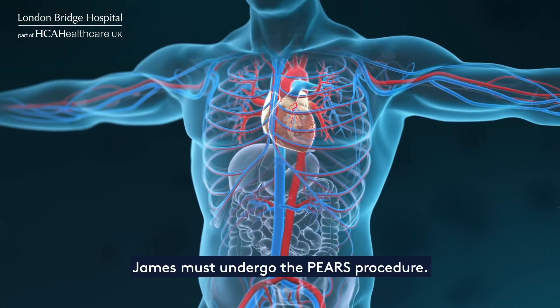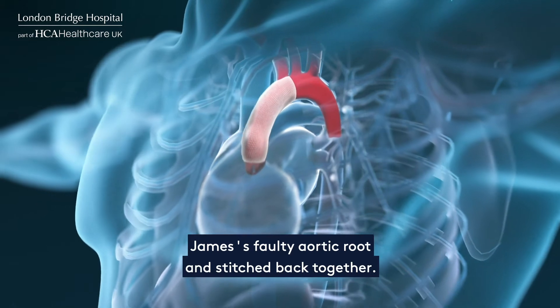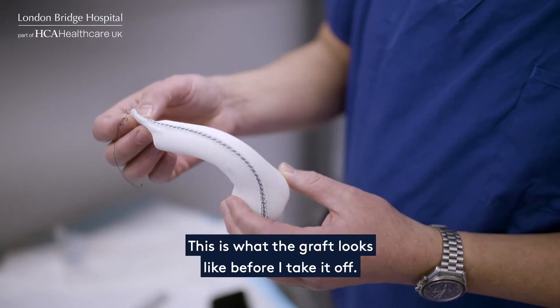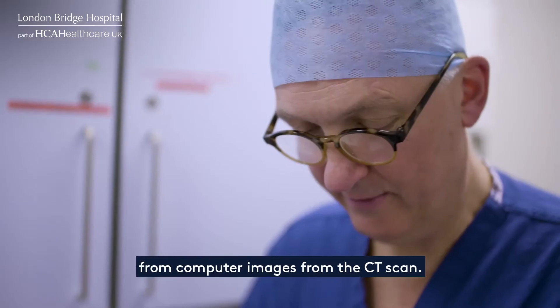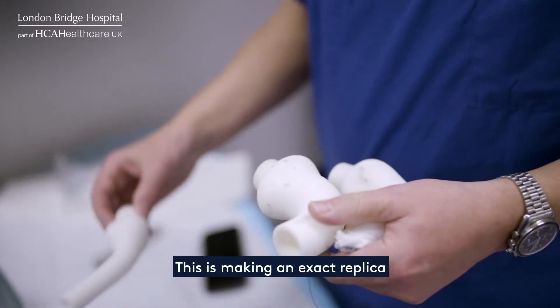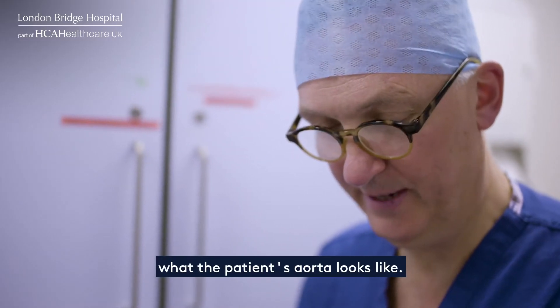To fix his heart, James must undergo the PEARS procedure. During the operation, a graft is wrapped around James's faulty aortic root and stitched back together. This stops the aortic root from widening further, lowering the chance of a rupture. This is what the graft looks like — it's a woven polyester graft. These grafts are made from computer images from the CT scan, making a 3D former using 3D printing. This creates an exact replica of what the patient's aorta looks like — personalised, not something you can lift off the shelf.